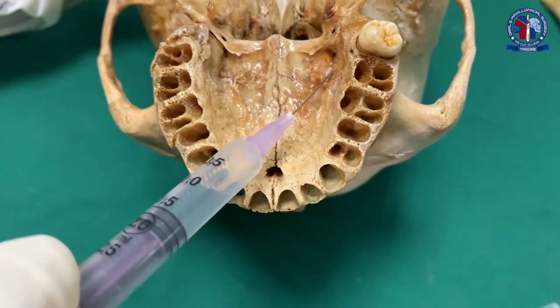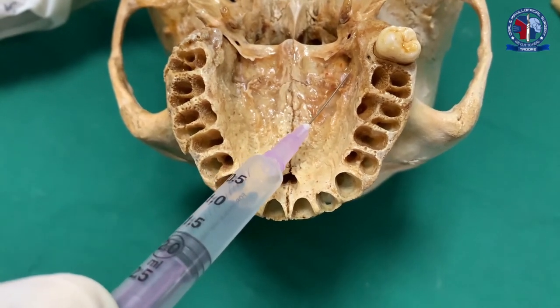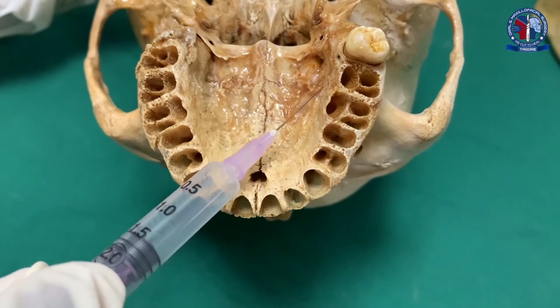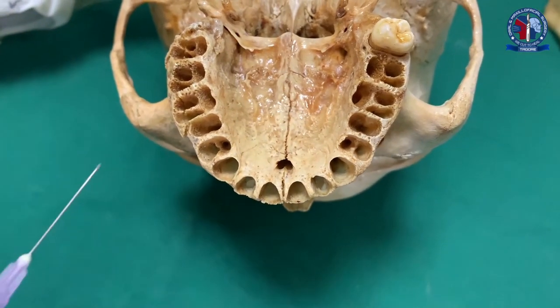Technique. A 25-gauge needle is inserted from the opposite side of the mouth at a right angle to the target area.